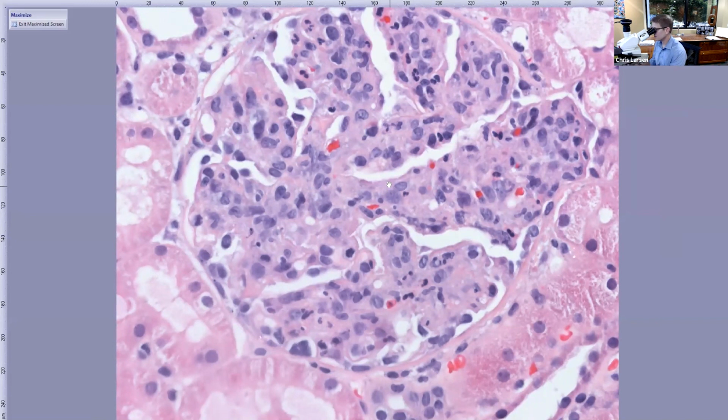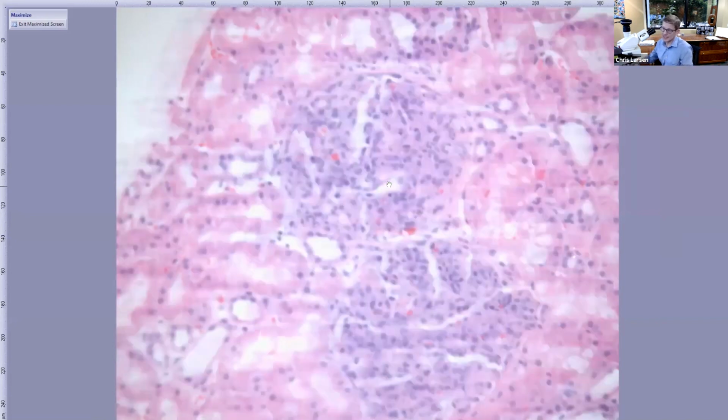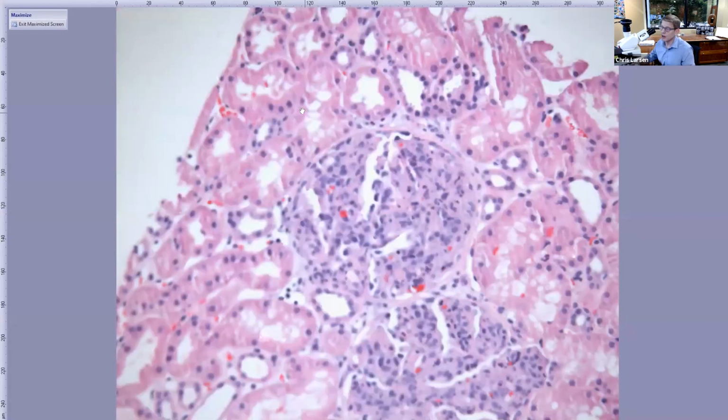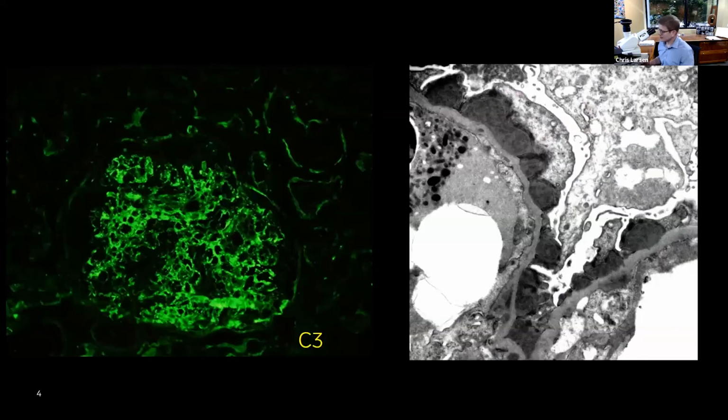So this is a so-called proliferative glomerulonephritis. You'll hear buzzwords like exudative, proliferative, and exudative glomerulonephritis. Classic picture for exactly what we would expect to see on this biopsy based upon the clinical history. Just as Alex said, every single case today is going to have the same IF pattern. This biopsy, while this was not the picture, did show C3 only staining.